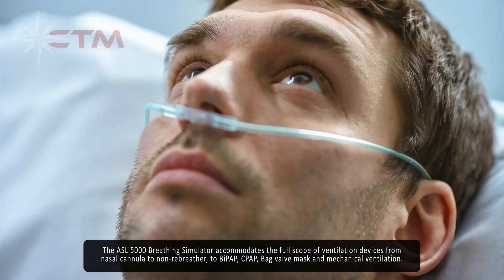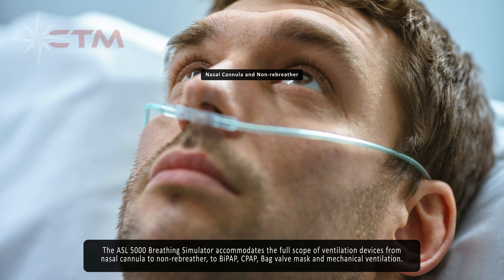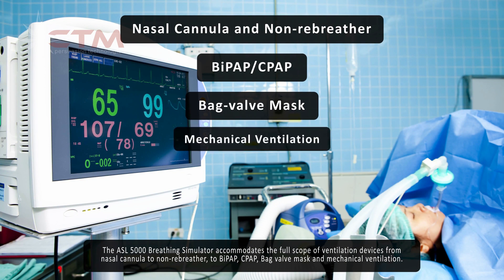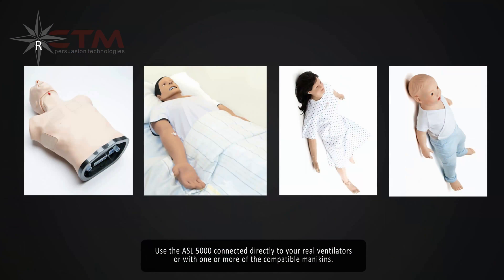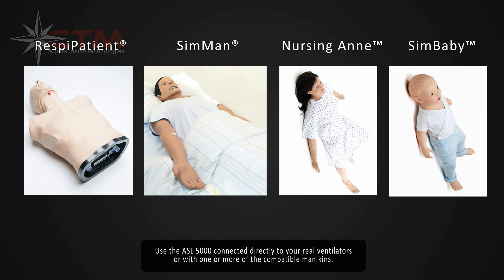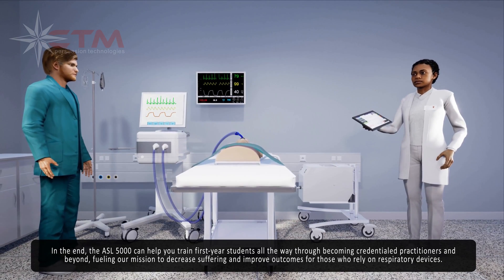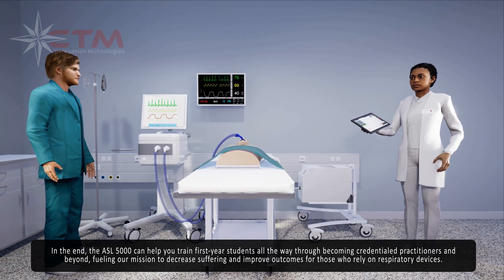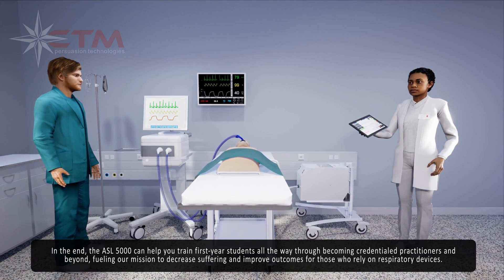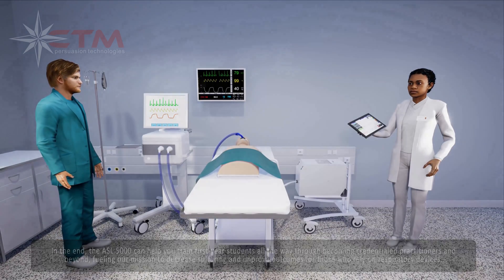The ASL5000 breathing simulator accommodates the full scope of ventilation devices, from nasal cannula to non-rebreather to BiPAP, CPAP, bag valve mask, and mechanical ventilation. Use the ASL5000 connected directly to your real ventilators or with one or more of the compatible mannequins. The ASL5000 can help you train first-year students all the way through becoming credentialed practitioners and beyond, fueling our mission to decrease suffering and improve outcomes for those who rely on respiratory devices.